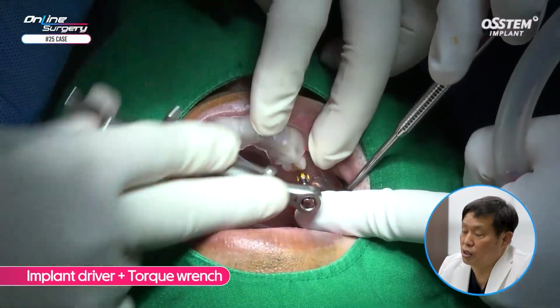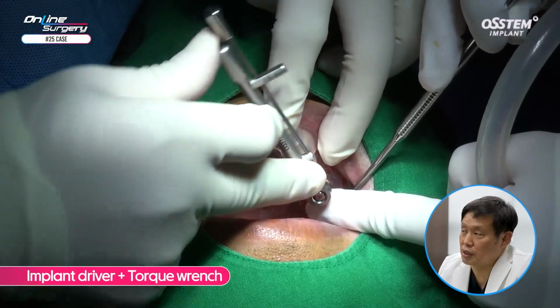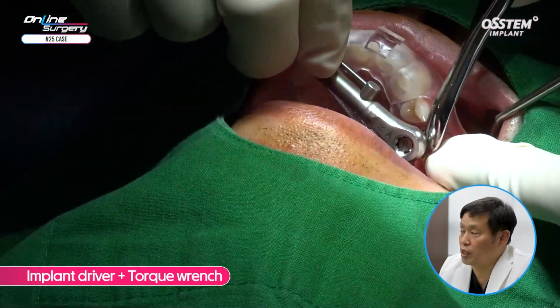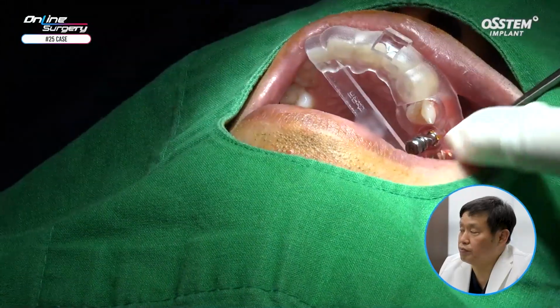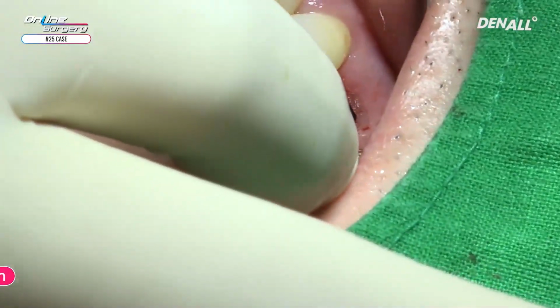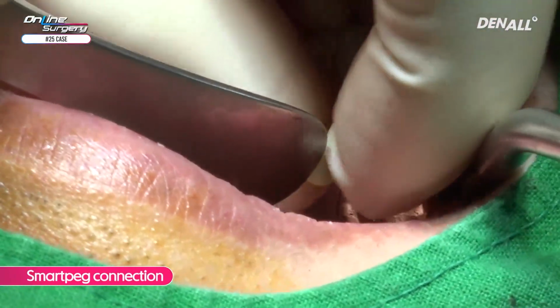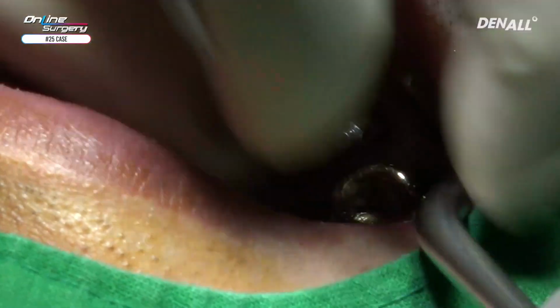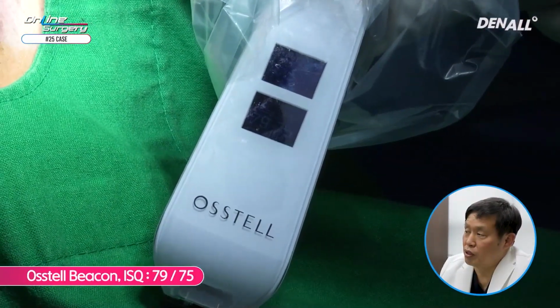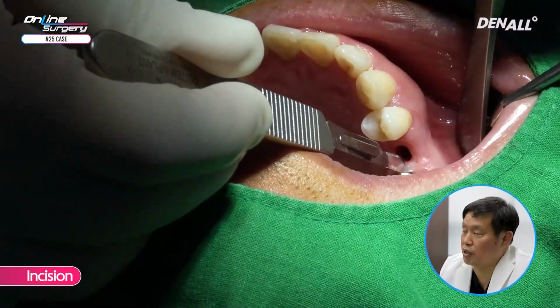The implant driver is used to position the implant. The final position is adjusted. If you take a look over here, primary stability is over 30 Newton centimeter, and it's much better than what was anticipated, so it's not going to be a problem. Implant placement depth and direction is being adjusted. The ISQ value is 79.75. It's very favorable. As shown on the CT, there was a defect on the buccal side.